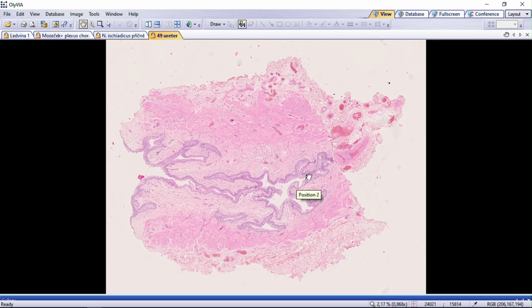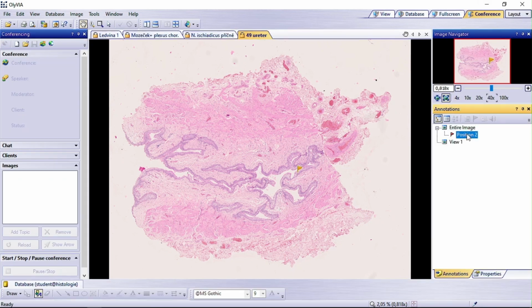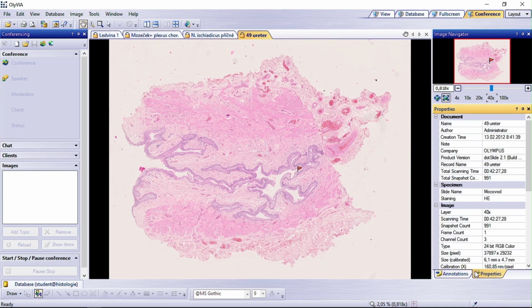You wouldn't find him as your friend. With an explanation, and I suppose the conference section is for the explanation itself. There should be some annotations, some notes which aren't present here. Doesn't matter. That doesn't bother us at all.